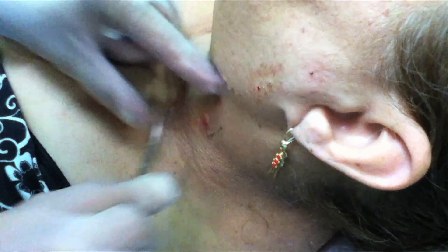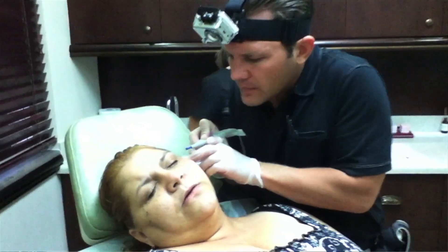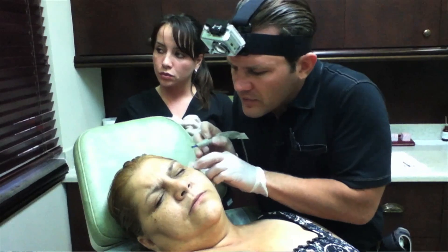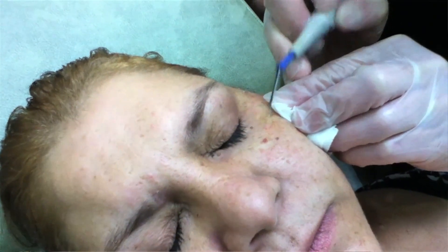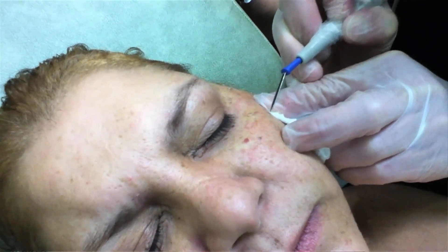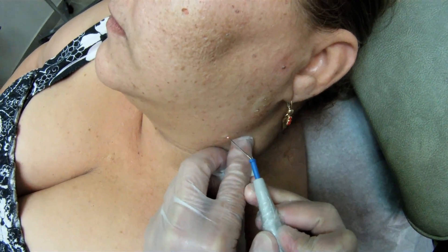And then we have a whole new set of problems. So now I'm going to go around and zap some of these things for you. You may feel one or two — I'm sorry. This is cauterizing the vessels and also preventing these things from coming back.